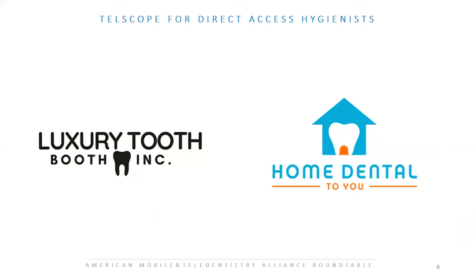I am really excited. In 2021, Teledentix was my choice of a software program for my mobile portable dental business in the Tampa Bay area. We were implementing the intraoral camera and a great radiograph system.